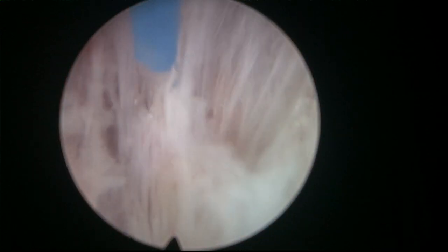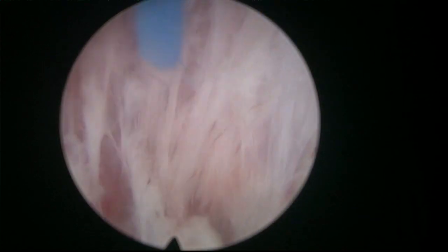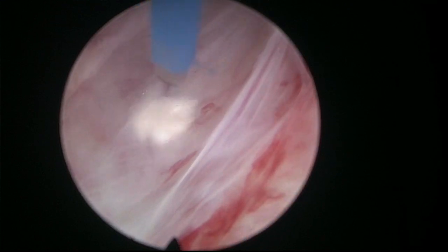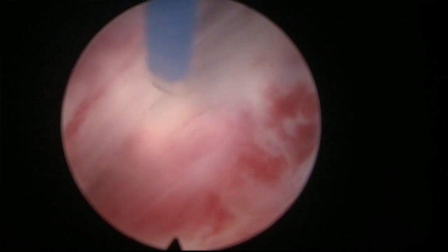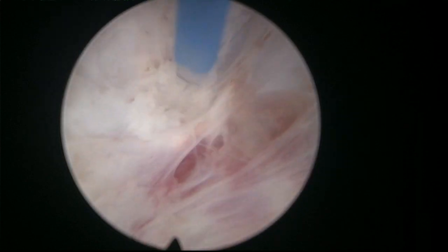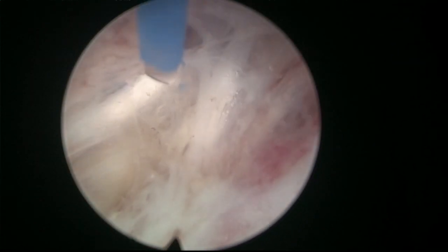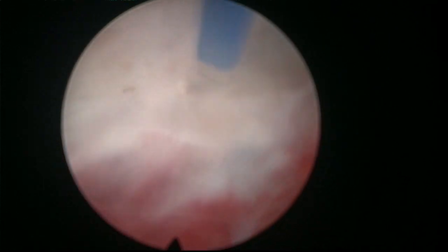Initially, it's a little bit strange to see this apical liberation, but the more cases you see, the more you understand it, and the more you are able to predict what I'm going to do next. Which means that you understand the procedure. It's very important to watch cases before you try to do it on your own, and of course, if you can have a mentor with you, it's much, much better.